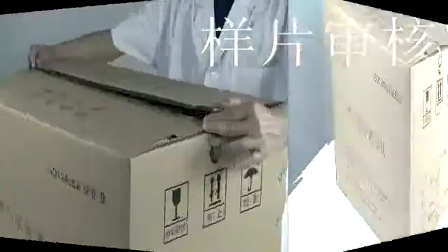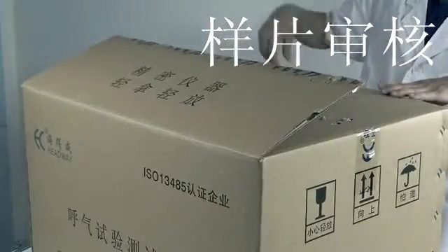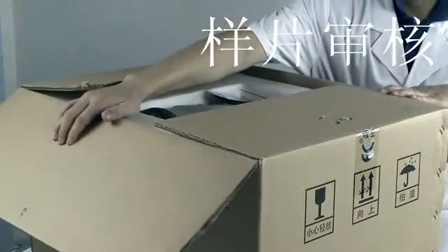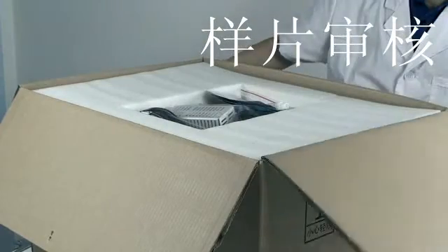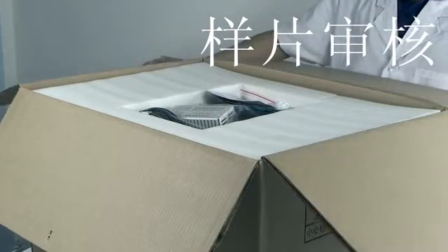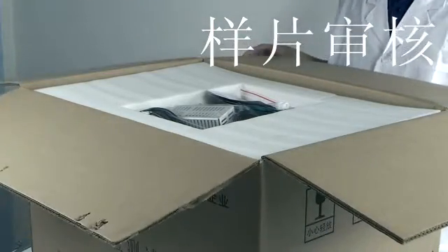Package dismantling: check if all items are intact and consistent with the packing list after unpacking. Check if the instruments are damaged or whether any parts or accessories are missing.